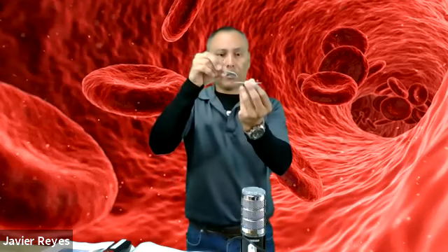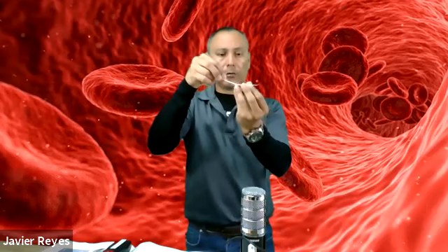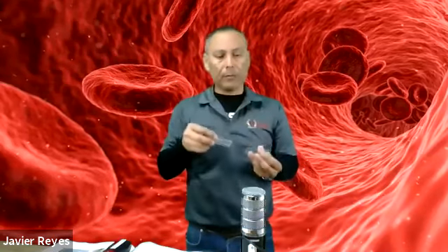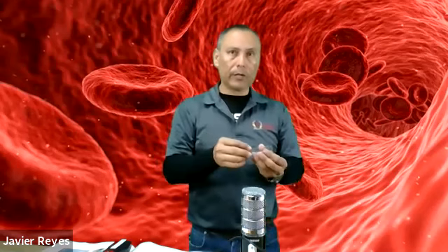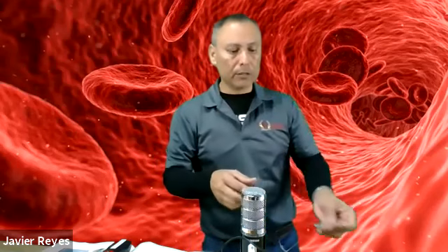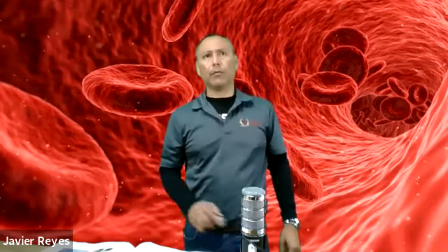Put the drop of blood here. Bring your second slide here. Let the blood go from side to side and then push forward and you should be able to make a peripheral smear that way. Again, there are certain criteria that you have to meet. We'll talk about it in just a minute so that you can create a good blood smear sample. Okay.